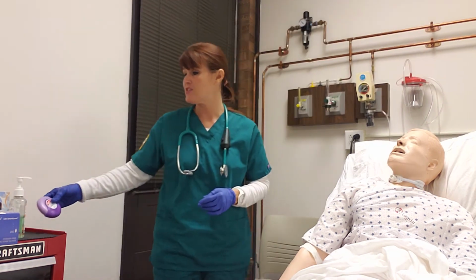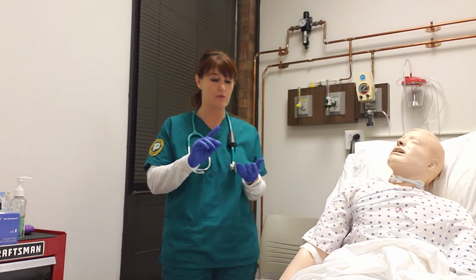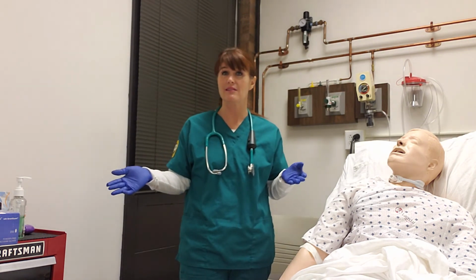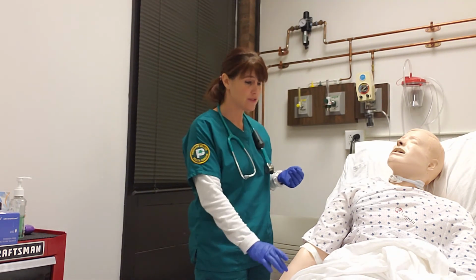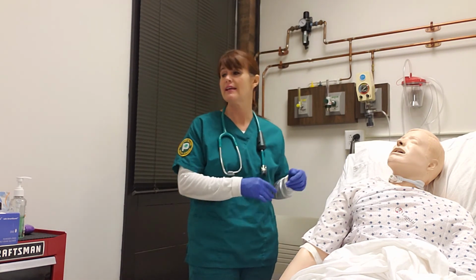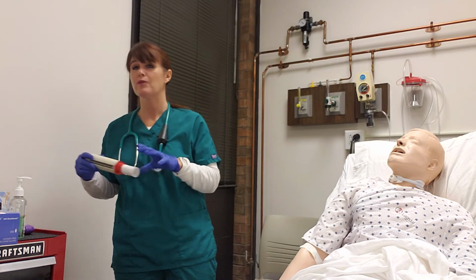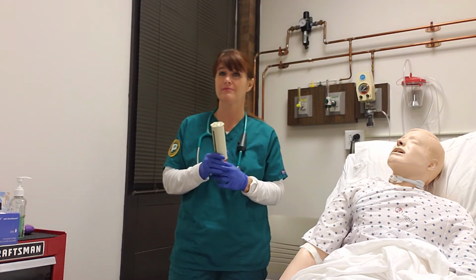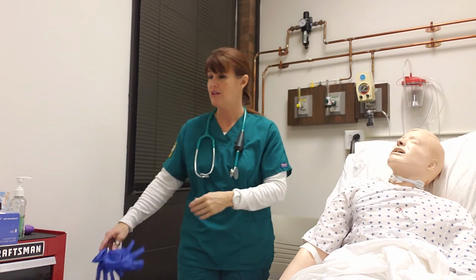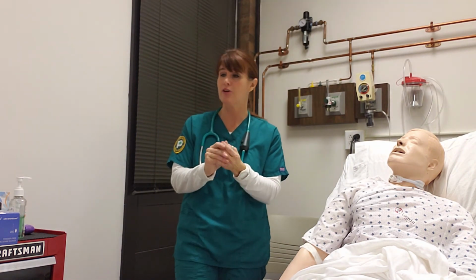Okay, so after the patient shows that they know their dose, when to take it, and how to take it, then you're going to go ahead and reassess the patient. You're going to do their pulse, get their respiratory rate, listen to their breath sounds, and again do a peak flow test. Okay, after that, remove your gloves, do proper hand hygiene, and go put it in the chart.